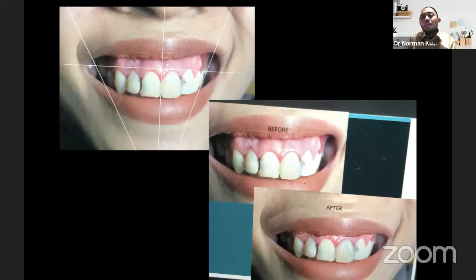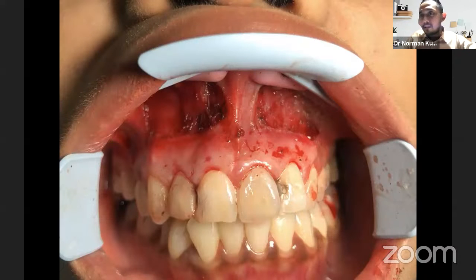So I think there is another way to give her a chance, a second opinion of treatment, excluding the conventional treatment, that is by laser. So I gave her a digital smile design projection, up and down, before and after, and she agreed, and we did the laser lip reposition. As mentioned before by Dr. Elizabeth, laser has a physical bio-interaction that can minimize bleeding by reducing arterial blood flow. The vasoconstriction in the blood vessels makes them smaller and can hold the hemostasis effect on the soft tissue, so the bleeding is minimal and the patient feels really comfortable during the operation.